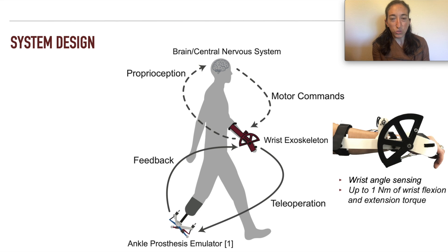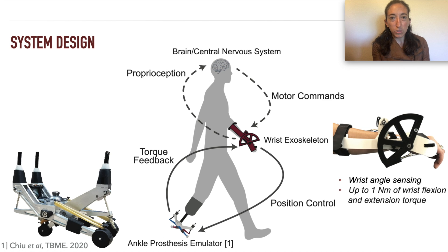To test this idea, we built a one-degree-of-freedom wrist exoskeleton capable of sensing wrist angle and transmitting up to one newton meter of wrist flexion and extension torque. We then developed a control strategy that interfaces with an ankle foot prosthesis by directly mapping the scaled wrist position to ankle position and providing scaled torque feedback from the ankle foot prosthesis.